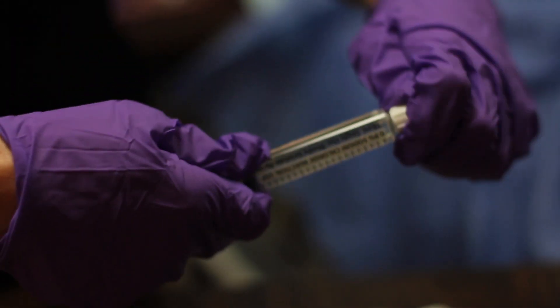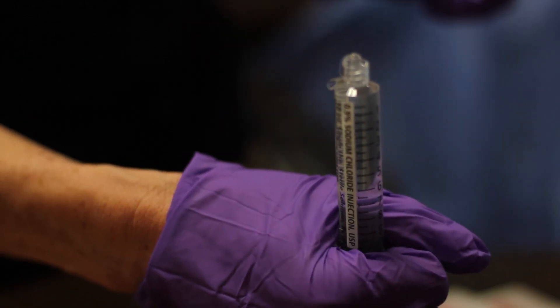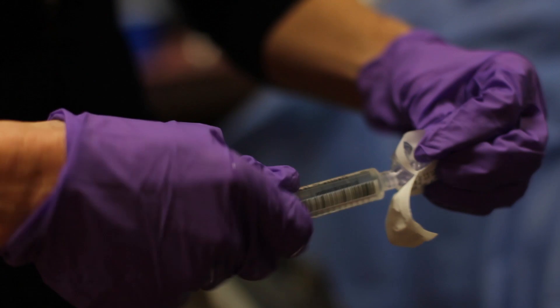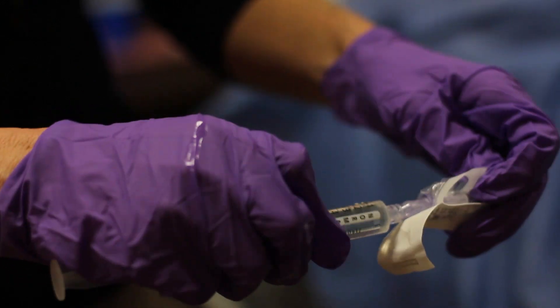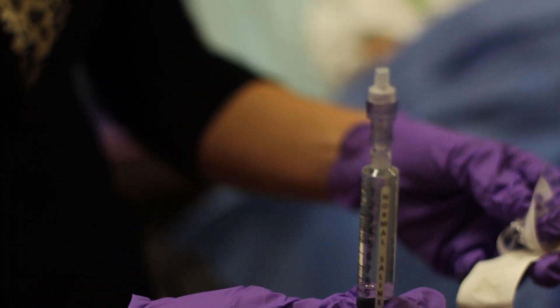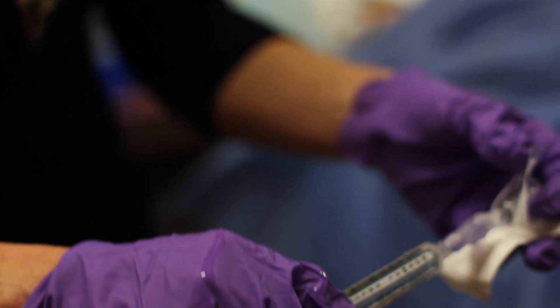Once at the bedside, be sure to prime your caps with the saline flushes, allowing them to be filled with solution and having no air in them. Keep them sterile within the packaging until you're ready to change the caps on the patient.